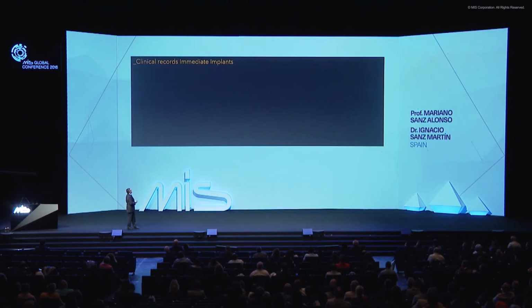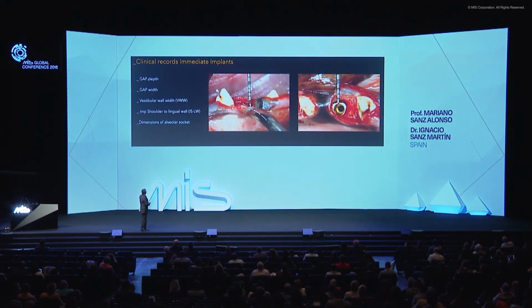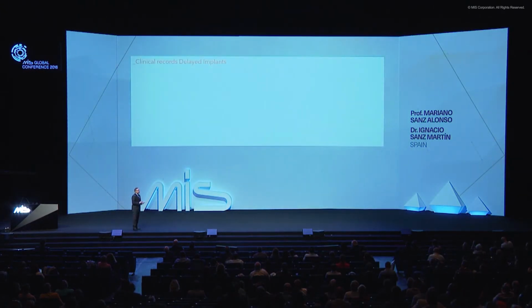And we basically did the same in the immediate implants, but also in the immediate implants, we measured the gap depth and gap width in order to understand what is the impact of the gap on top of the gap that the test implant has due to its coronal design. So with these measurements, we could understand the impact of the site where we were going to place our implants.